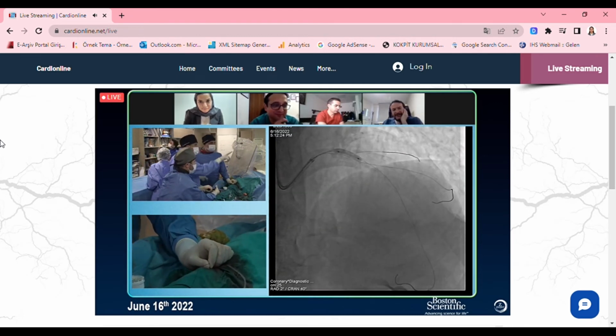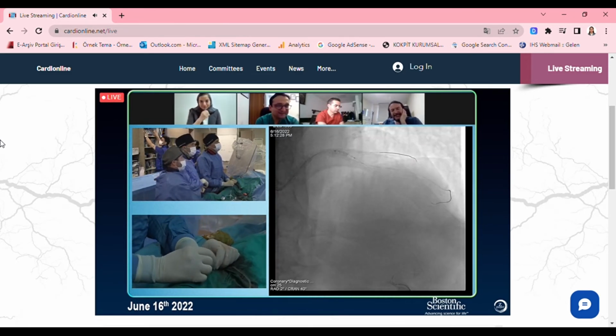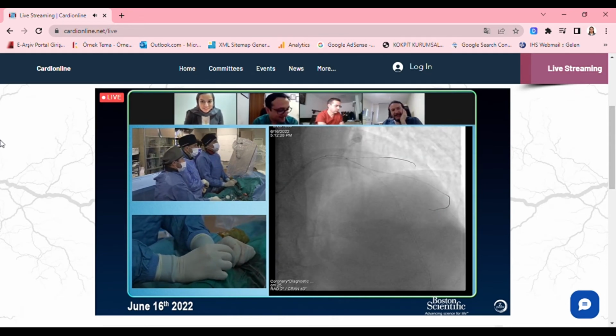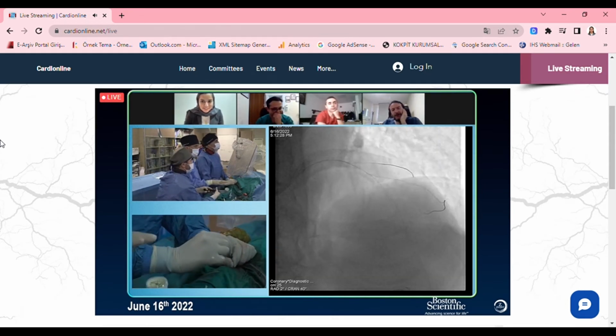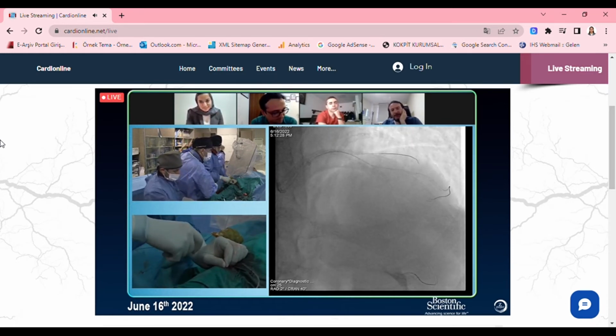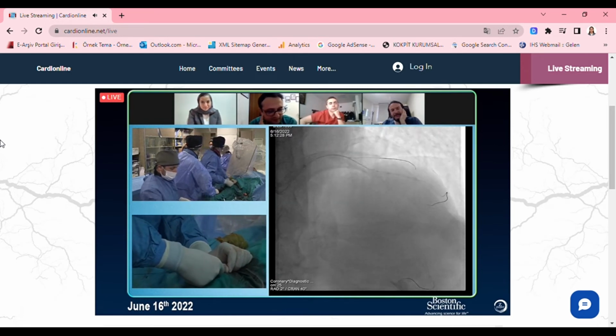Cutting. Yeah, proximal opening is first, good. NC, then cutting balloon, or scoring. Cutting or scoring? This is a Boston session, so I think we are going to do a Wolverine. They don't have the scoring balloons. Yeah, I think okay.